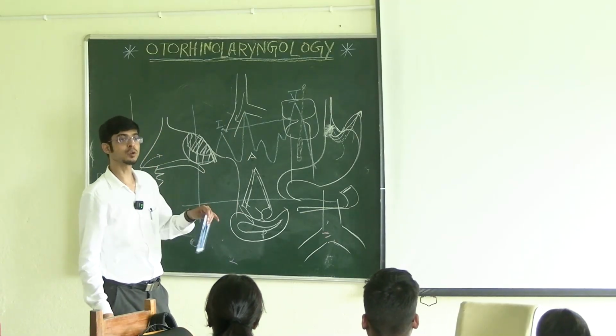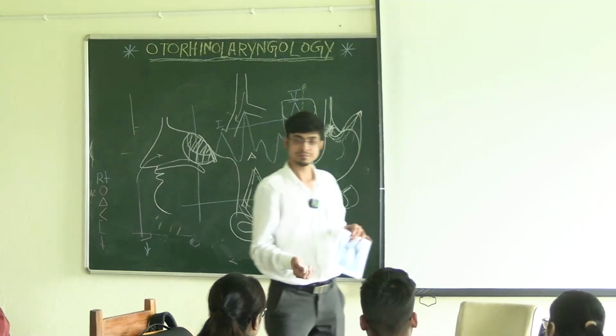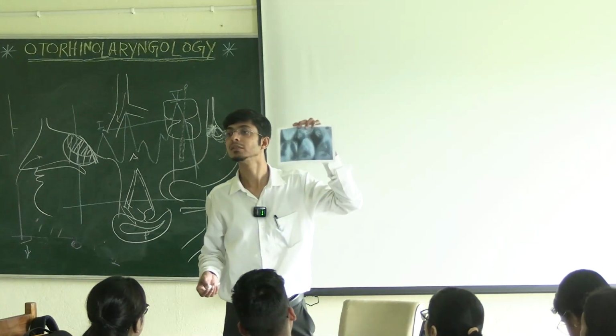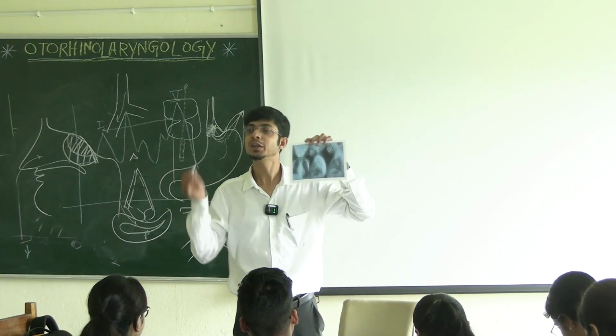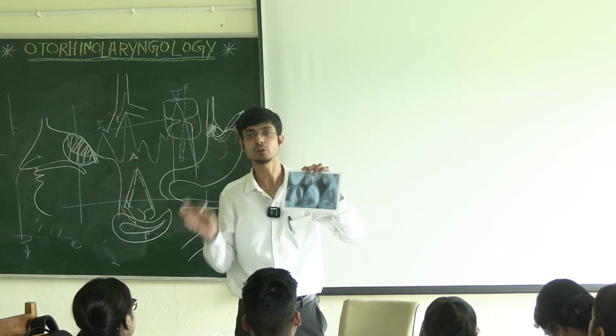Even when we are doing a bronchoscopy, it is much easier for us to see the right bronchus than the left bronchus. Okay. So what procedure do you do? Rigid bronchoscopy. Okay. Direct visualization and taking the foreign body out with grasping forceps.